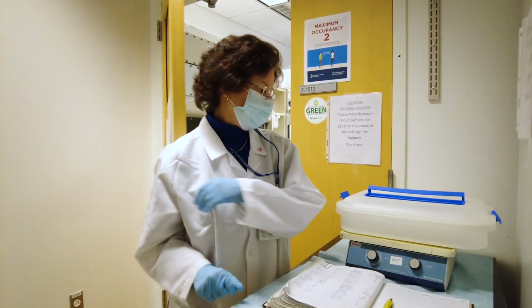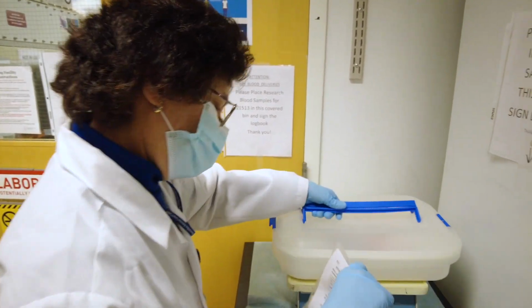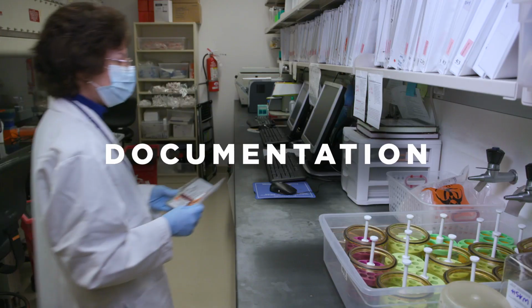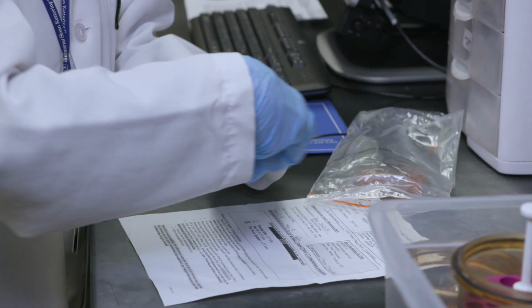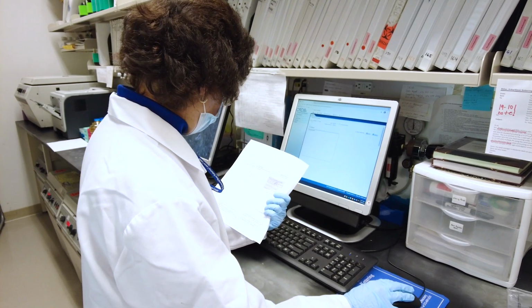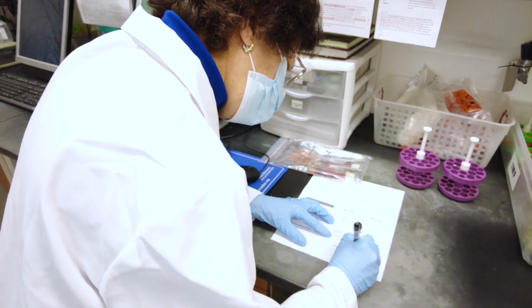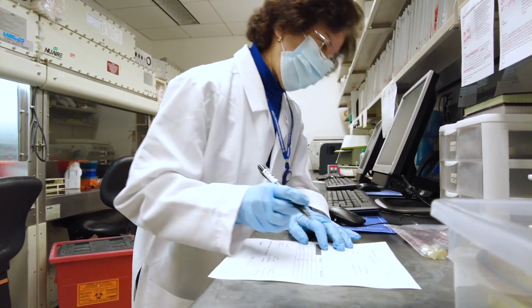Lab members frequently check the bin outside the processing room for new samples so that the samples can be processed quickly. The sample is then taken into the processing room and documentation begins in order to ensure accurate sample tracking. The lab member adds information to the requisition form, such as the time blood processing began, how many samples were received, and which study protocol the samples are for.